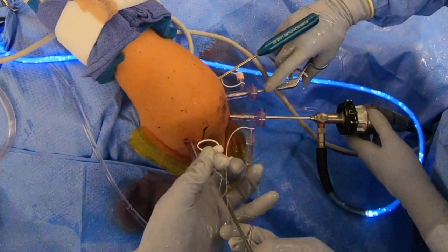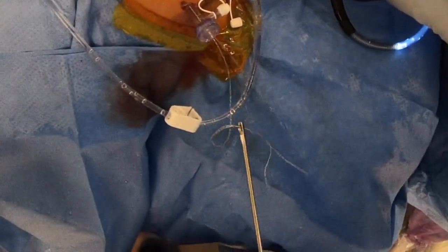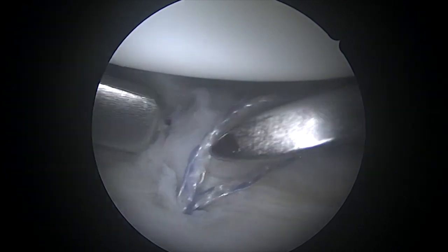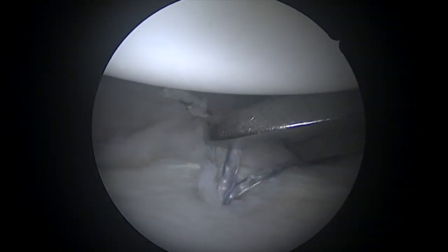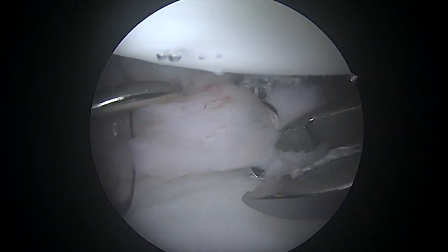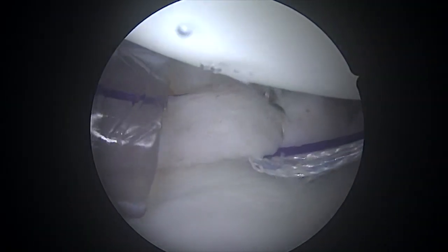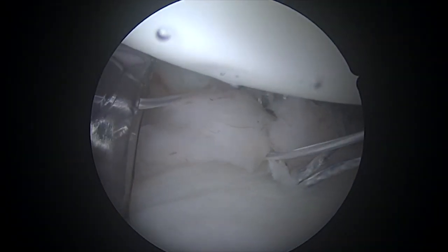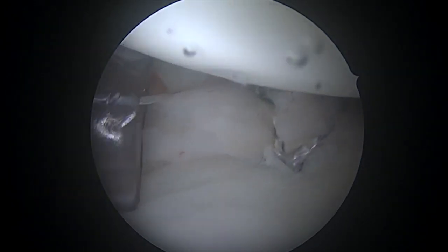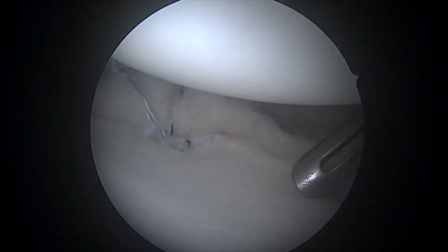Once those knots are all tied, we'll cut those here, and then we're ready to pass our next suture. This becomes very much a rinse-and-repeat process, but as we go, I'm going to try to get more and more plication. With each anchor, you can get more and more capsular advancement to try to get the shoulder tight enough that it'll be stable, which can be a real challenge in multidirectional instability patients.